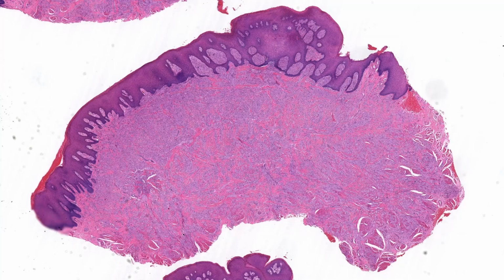The first and the best place to start is at low power. Things to describe should include location, relation to normal tissue, and initial impression, such as color, cellularity, and the presence of hemorrhage or necrosis. For this case, we have a lesion located just below the epithelium, which seems acanthotic or thickened. This could be due to external trauma or a reaction to the underlying tumor.